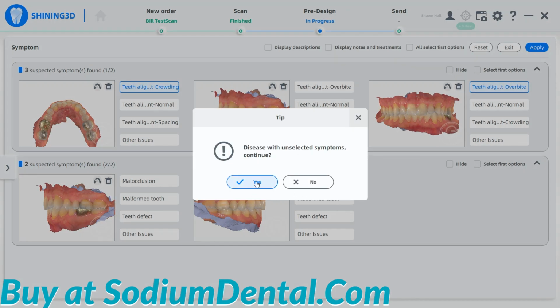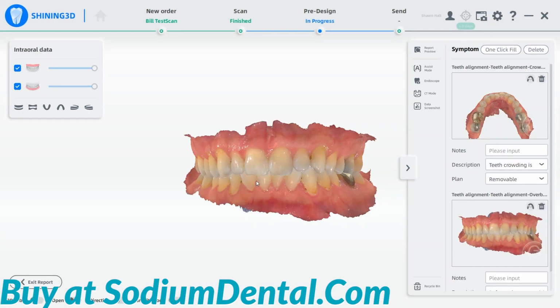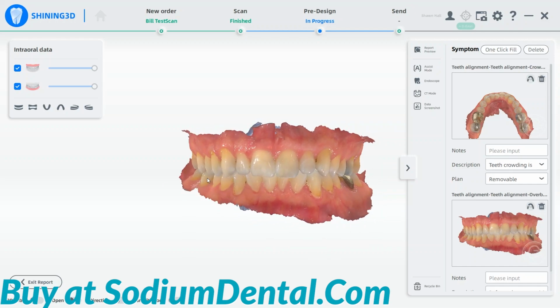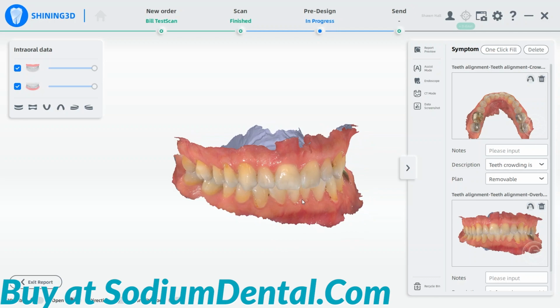Apply. If you would like to draw attention to aspects of the oral health that were not mentioned in the AI, I suggest using the easy tool, Data Screenshot.